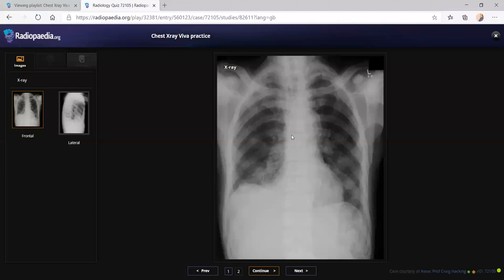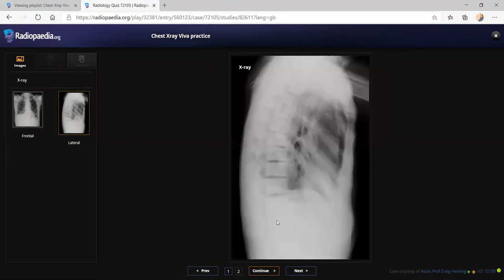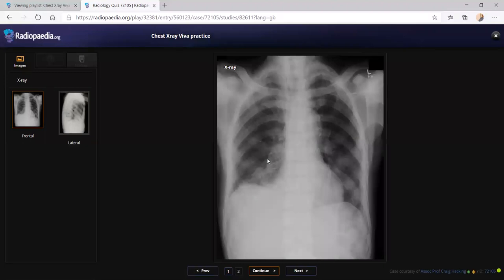Okay. So in this case, you forgot the history that I gave you in the beginning. Foremost, we should not make up any findings. There was no H-shaped vertebra. I gave you the lateral view to see the end plates. The end plates were very straight. So you have to apologize and take back that statement, retracting the statement of H-shaped vertebra. And don't diagnose sickle cell disease in a 70-year-old male. Only then did you come to the realization that sclerotic metastasis should be at the top of the list. Otherwise it was okay with prompting.